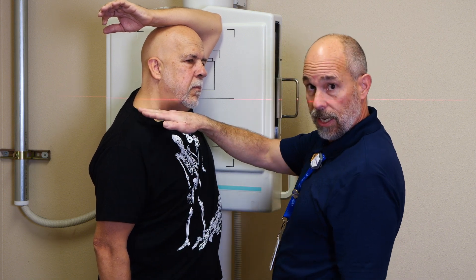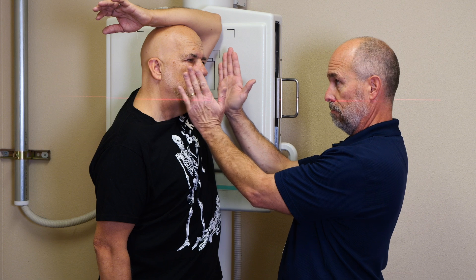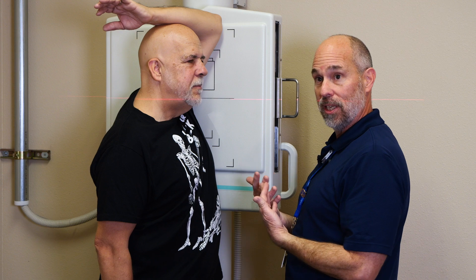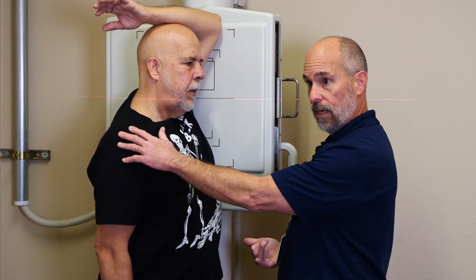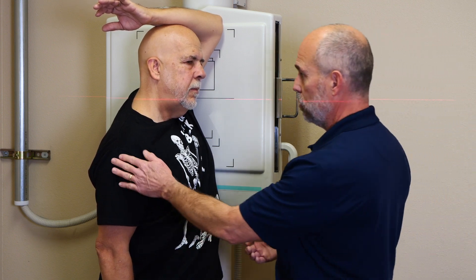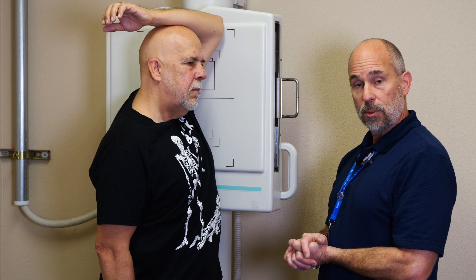At this point we're going to center at the C7T1 juncture, which is about the base of the neck. Make sure the patient's head is nice and straight. We're going to have him suspend respiration — I prefer on expiration, just to drop that shoulder down. Go ahead and hold, then expose the image. And there's your swimmer's view. Make sure that we're collimated to include the lower cervical and the upper thoracic region. And that's your swimmer's view.